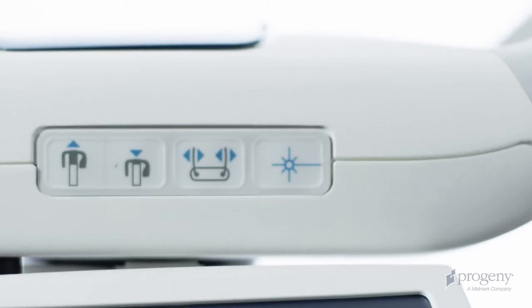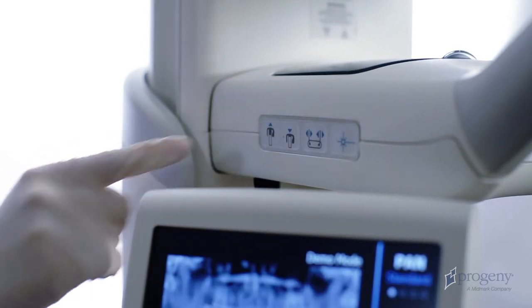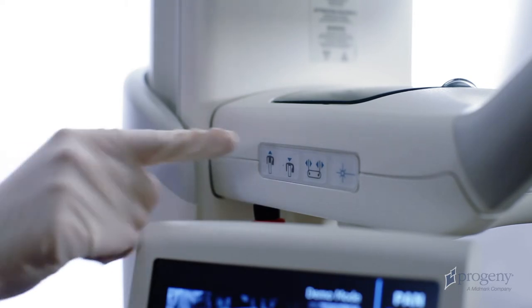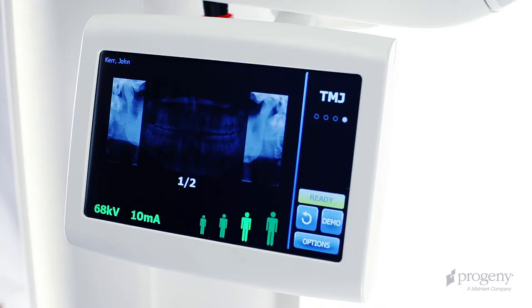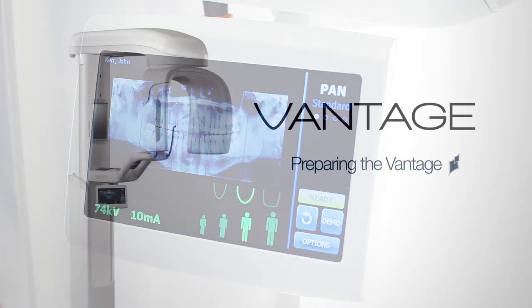On both sides of the positioning table, we have the control keypad, column height adjustments, temple wands control, and the alignment lasers. Below the positioning table, we have the Vantage touch operating panel.